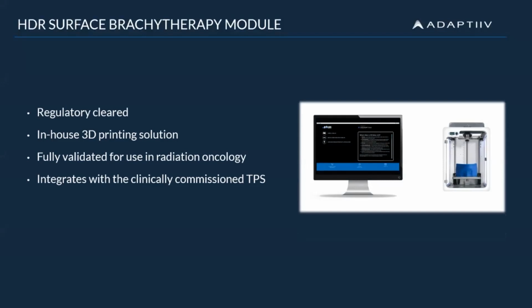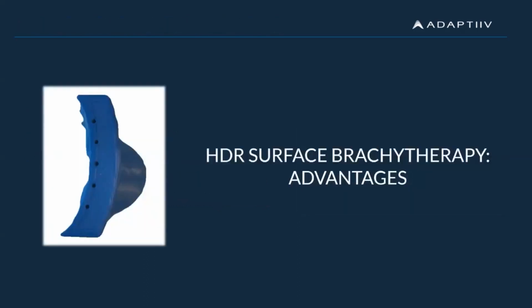We directly integrate with your clinically commissioned TPS. This allows you to optimize the fabrication process through digital design, where you can import the DICOM files into our software and then back to the TPS for validation and for quality assurance. We also allow users to reduce the time and skilled labor that is required to produce an applicator that can be used clinically. So there are some major advantages, and I'm going to run through that one and some more before we get to Borko and him showing us the new features in our software.